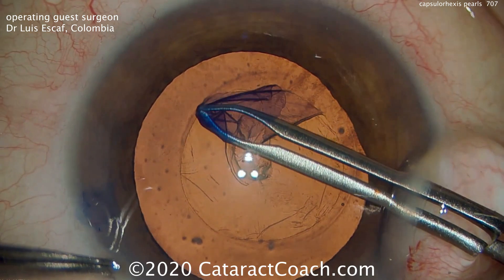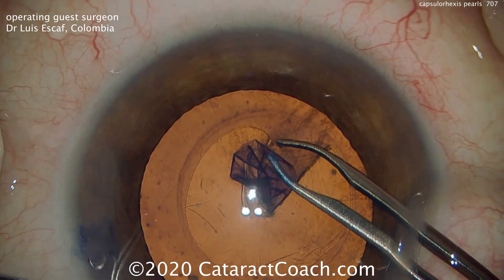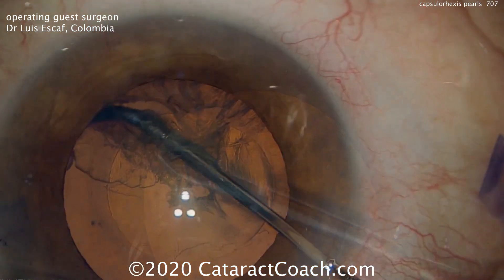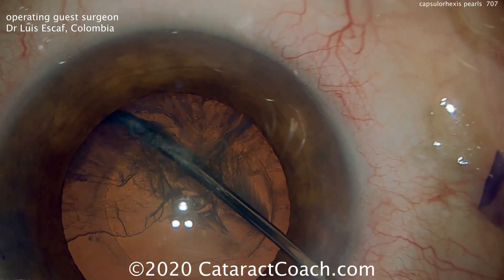Finishing up the capsulorhexis, you can see that guide that was made at the beginning — that mark on the corneal epithelium — is quite useful. That allows the surgeon to make a very precise capsulorhexis.